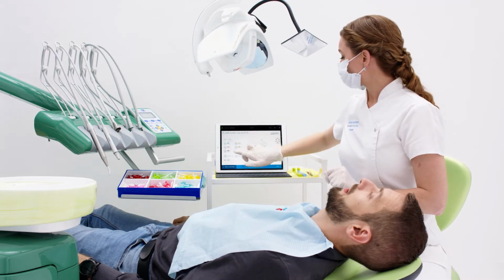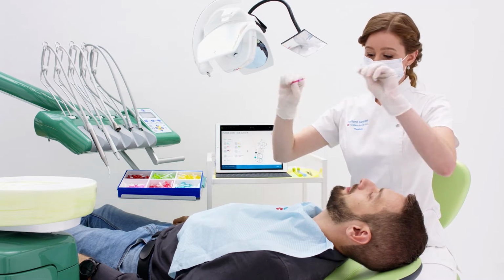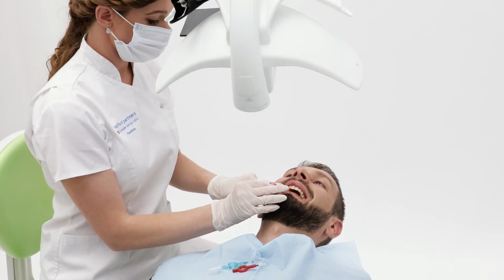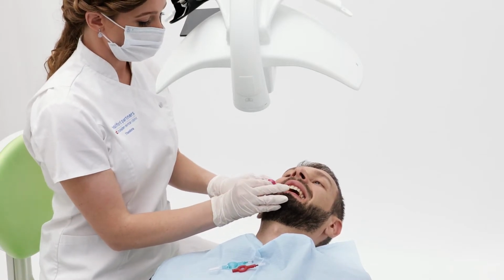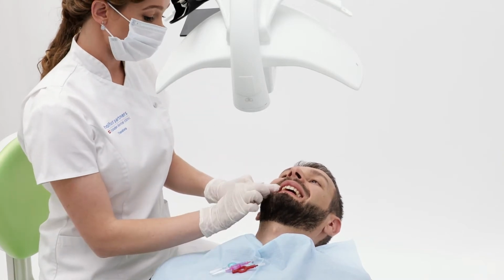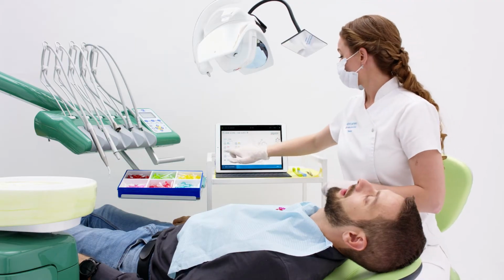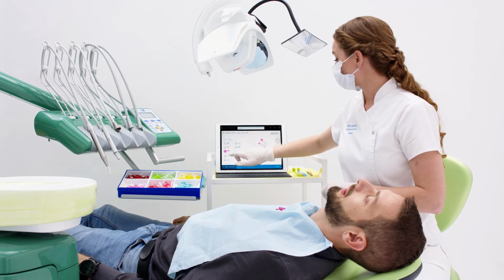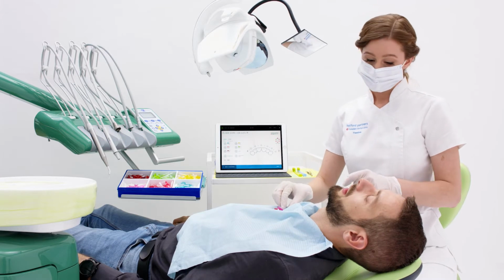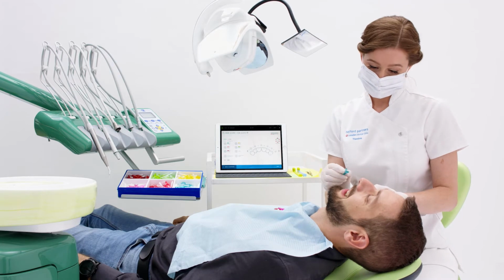I input this brush into the Bob score by clicking the Others button, which appears then as a grey circle on the chart. I then use the pink Prime brush, and Edward again watches the technique I demonstrate with the attached mirror above him. As I place this 3rd aid into the score, a notification reminds me that I have now input 3 or more aids and asks, is my patient confident and competent to use this many?